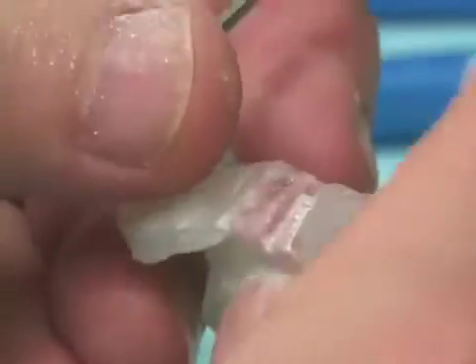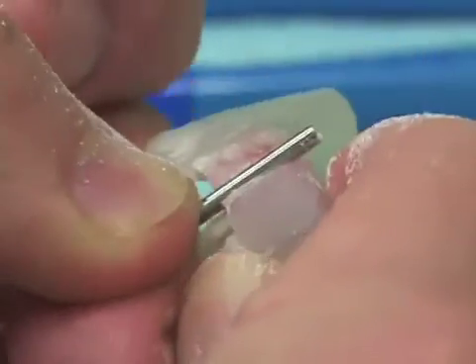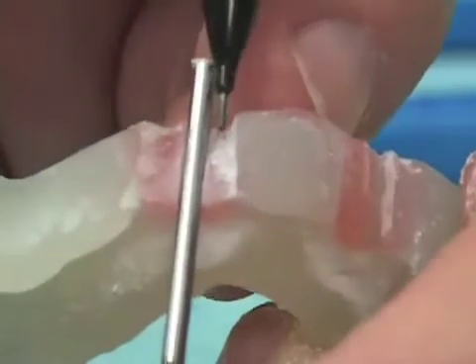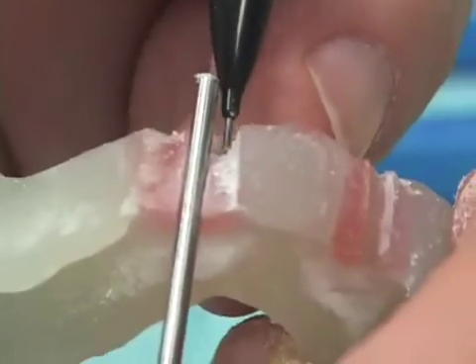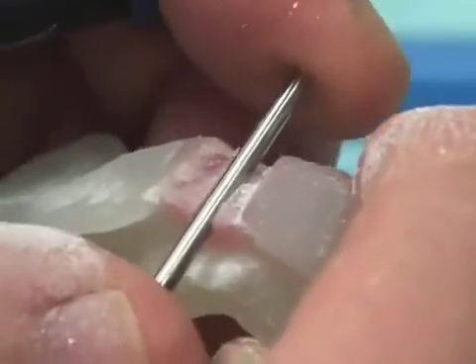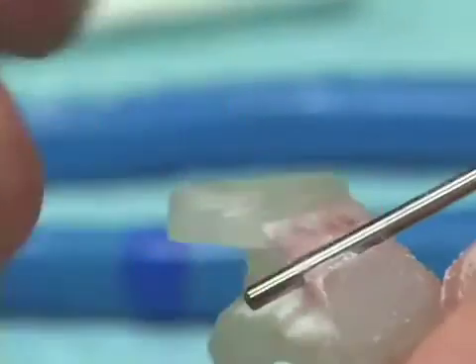We'll do the same thing to our other implant position. So when I put it in, it's a little bit tight. Now, one thing that this shows up fairly well is there's a small void in this area where not enough triad gel got around the drill blank on the mesial aspect. It's held in quite firmly in that position, and it doesn't freely come out to the buccal.